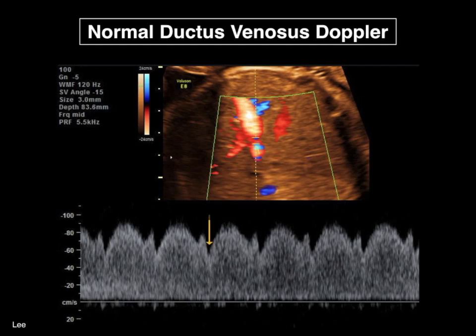The lowest late diastolic velocity represents atrial contraction that is normally found with continuous diastolic flow throughout the cardiac cycle. Potentially compromised fetuses can be suspected when this atrial contraction, or A wave, shows decreased, absent, or reversed diastolic flow, especially in growth-restricted fetuses.